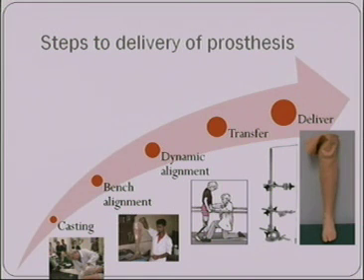The rest of this lecture is going to be over bench alignment. And so the rest of this lecture is not going to deal with casting, dynamic alignment, transfer, or delivery. It's just going to deal simply with bench alignment. So this is the phase we're in right now.